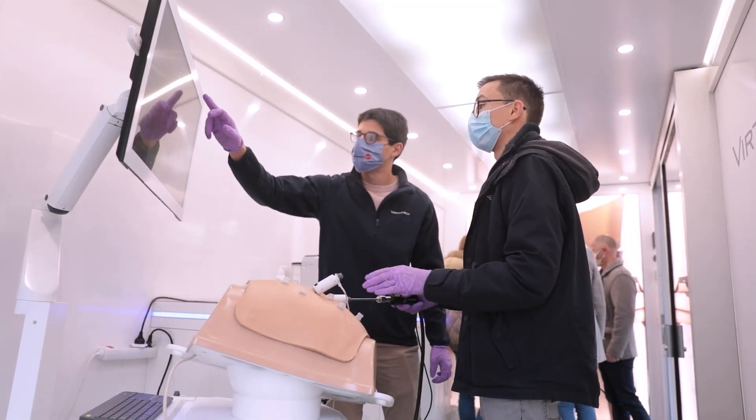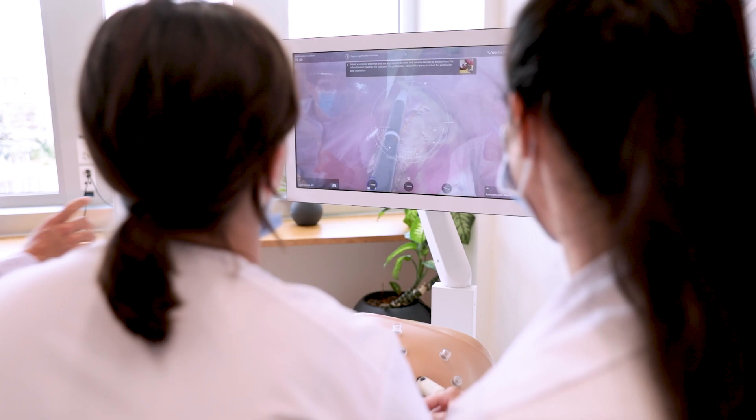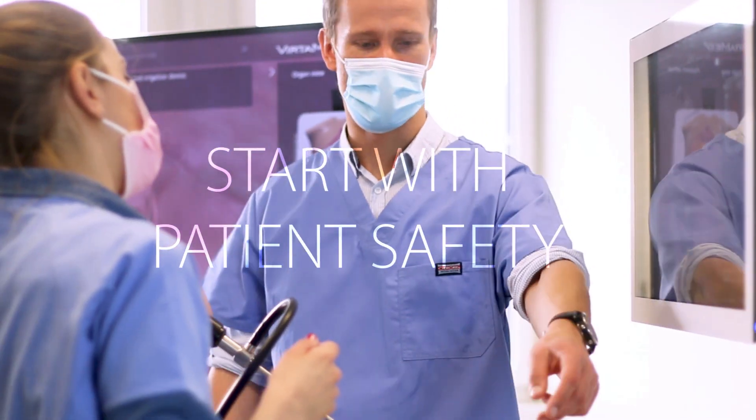Laparoscopy training that improves outcomes and supports better patient care starts from the beginning. Start with patient safety.